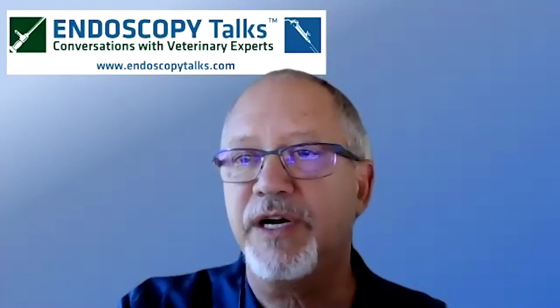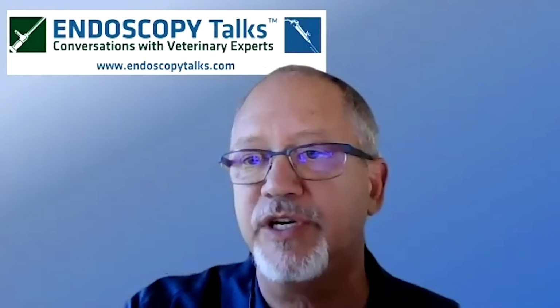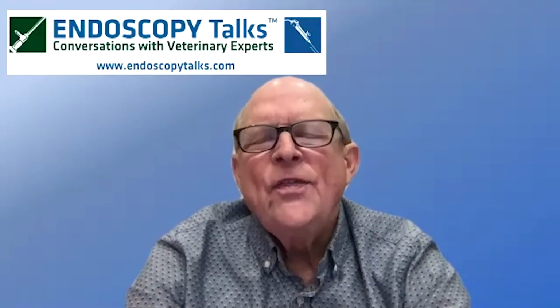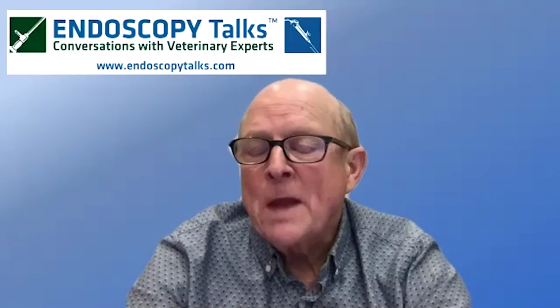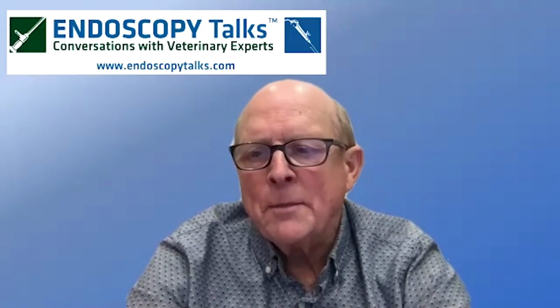Okay. A couple of similar questions here are asking about esophagostomy tubes or gastrotomy tubes, I should say, or what you recommend for post-removal feeding, especially if you're concerned about the level of esophageal damage. With an esophageal tube, going into the esophagus, that is going to heal up very, very rapidly. I generally pull my esophageal tube. I usually take a little betadine ointment on a 4x4, put it over the area, and let it close up with time. I generally will go ahead and feed these animals afterwards. Same thing with a gastrotomy feeding tube as well. I often will put a stitch in the skin just so you don't have gastric contents coming out through the fistula of the gastrotomy feeding tube.